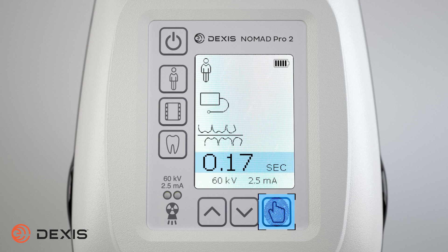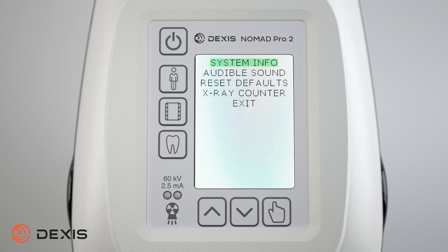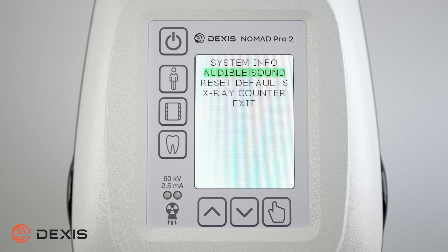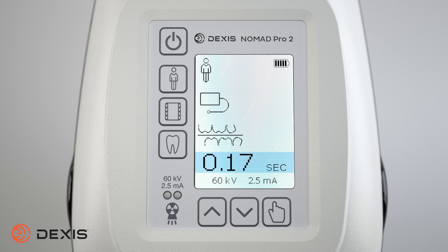To access the main menu, press and hold down the select button for three seconds. When the main menu appears, you can select the desired menu items by pressing the increase and decrease buttons to scroll up or down. When the desired menu item is highlighted, press the select button to select the item. With each menu item, there are options which are selected using the increase and decrease buttons. Once the selection is made, the select button confirms the choice. To exit the main menu, highlight exit at the bottom of the list and press the select button, or power the device off and on.